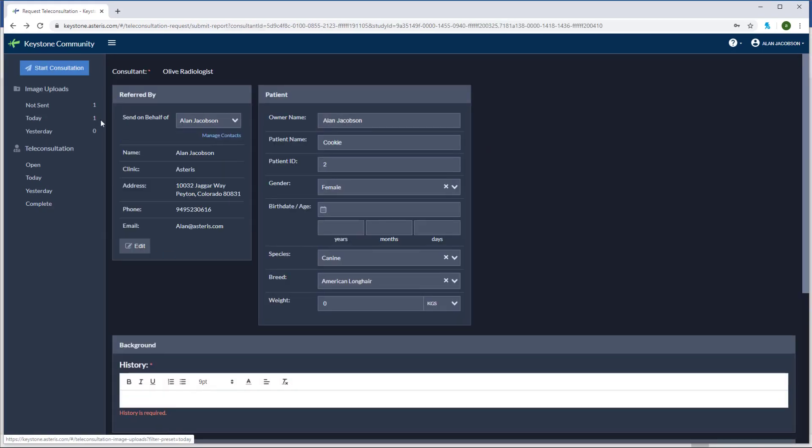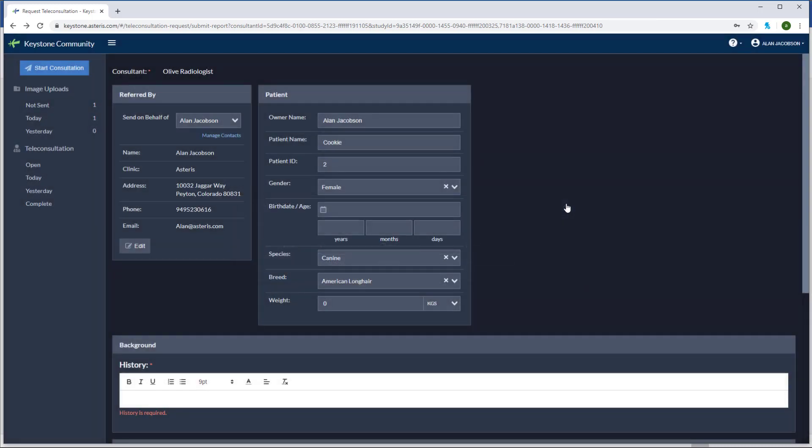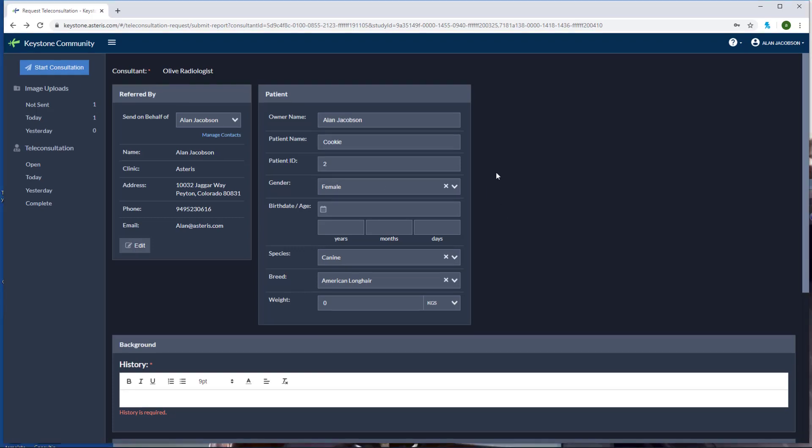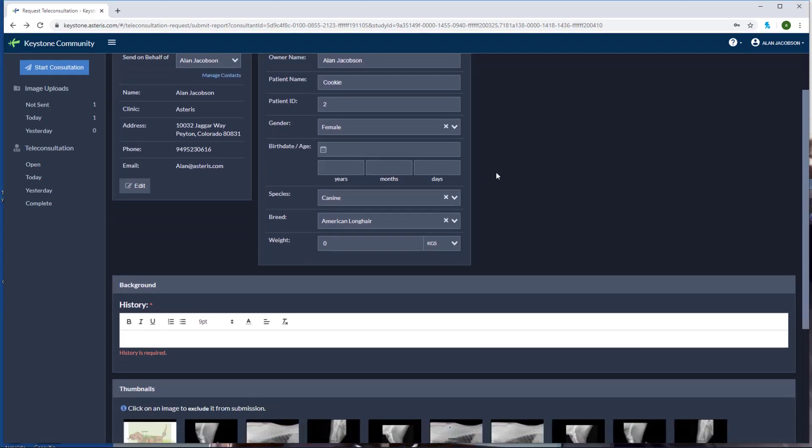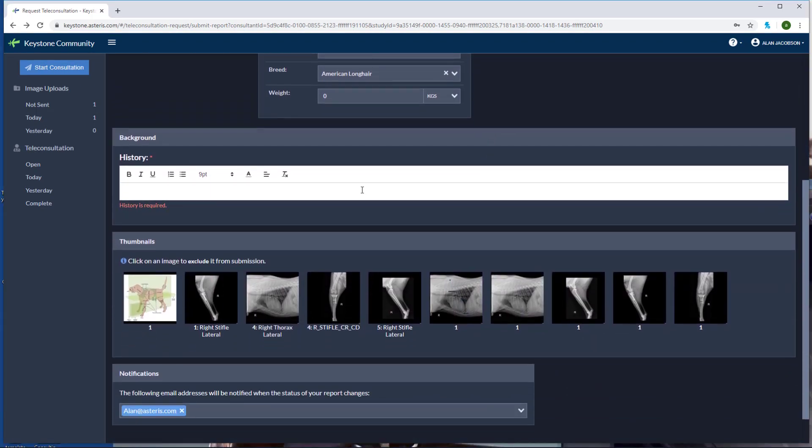In this next section we have referred by, patient, and the history. Referred by we can adjust. If you'd like to set this up for a specific doctor, feel free to add contact and any of the doctors in your facility can be added. We've also got the patient information here. Make sure all of your information is correct. Add any changes like weight, birth date, gender, or even patient ID here.